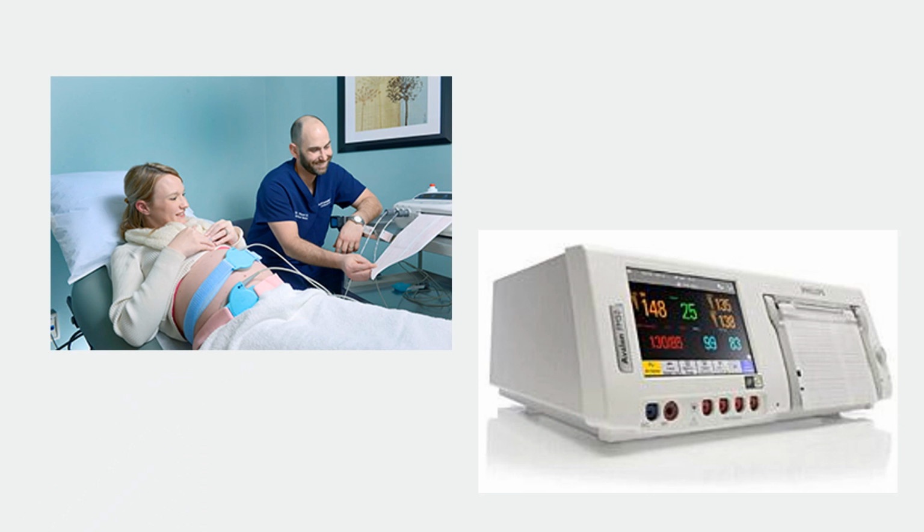I want to first begin by letting you know a little bit about the history of fetal monitoring. It was studied in the 1960s comparing it to Doppler. And what they found is that fetal monitoring was shown to decrease the risk of stillbirth in fetuses. By the 1970s, 60s to 70s, fetal monitoring became more widely used.